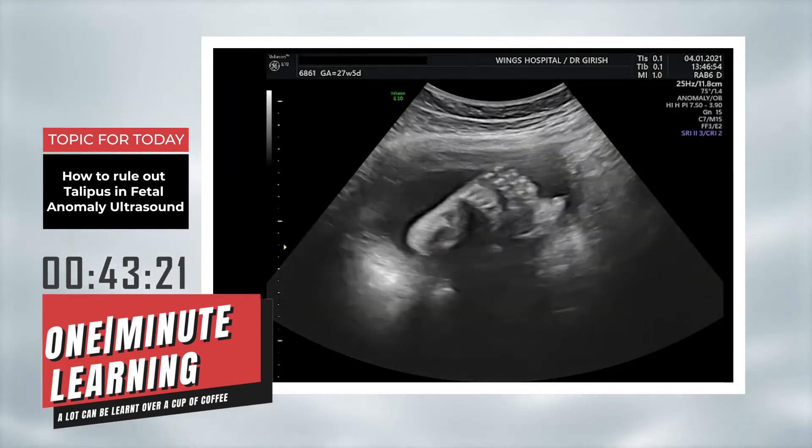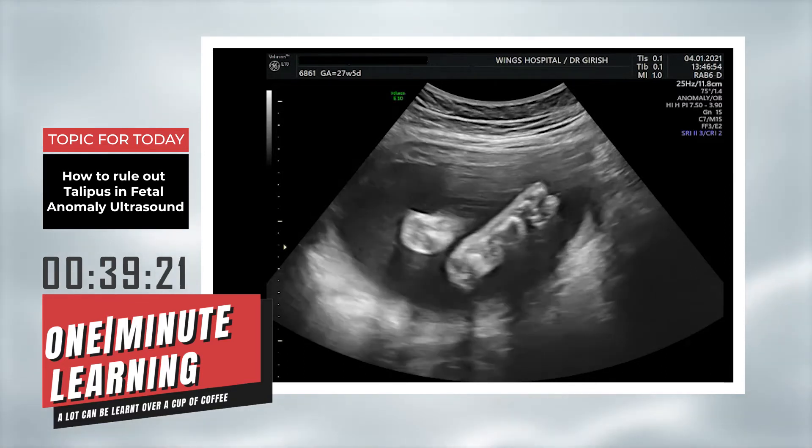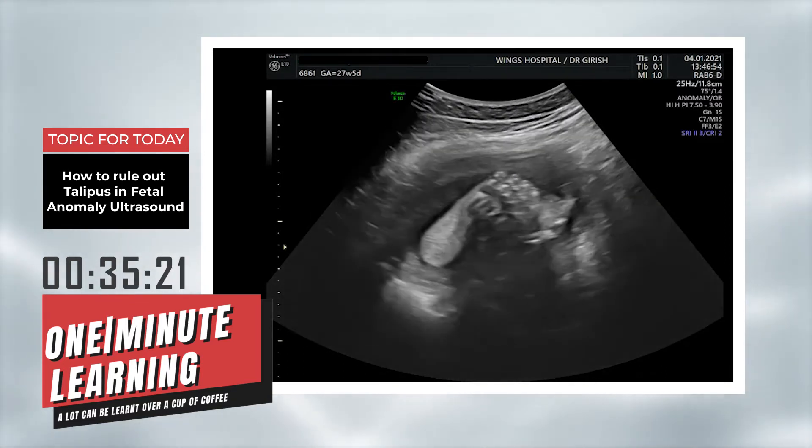Today I am going to show you a fetus where, if you can see both soles of the feet side by side, you can easily exclude talipes. Now let us see the video. If you see both soles of the feet side by side, we can easily rule out talipes.